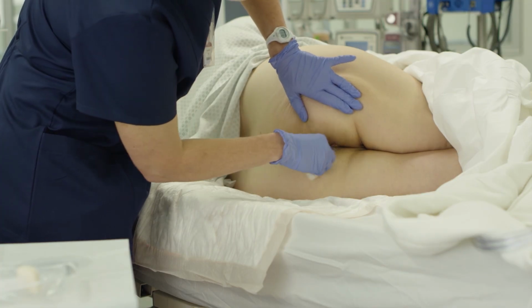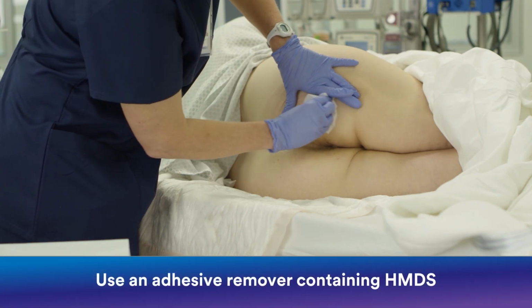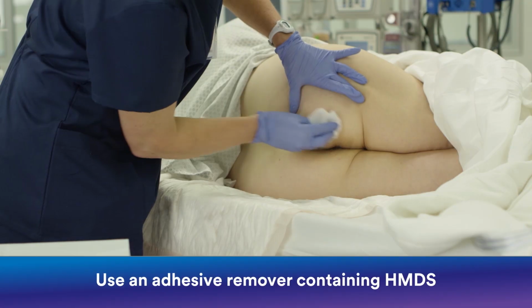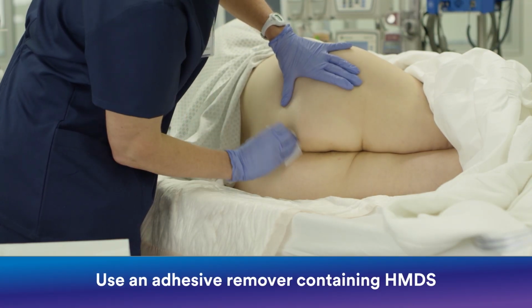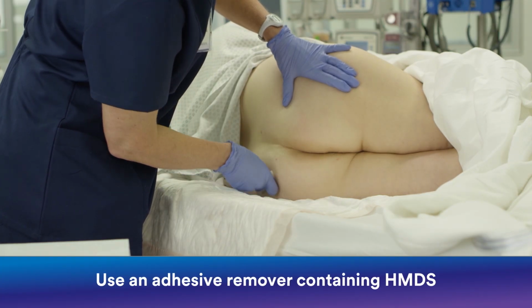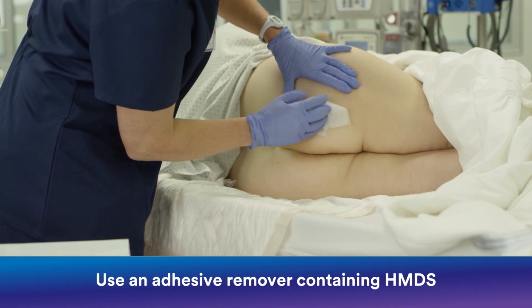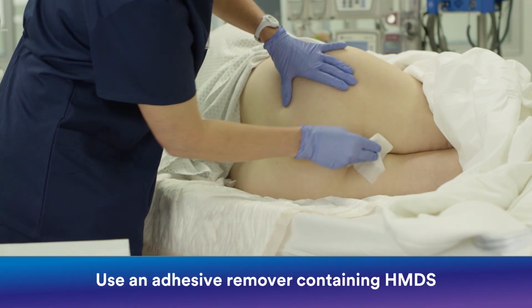However, in the event you must remove the product, use an adhesive remover that contains hexamethyl disiloxane or HMDS. It's advisable to use an adhesive remover containing HMDS anytime you remove an adhesive dressing or tape from an area that has been covered with 3M Cavilon Advanced Skin Protectant.